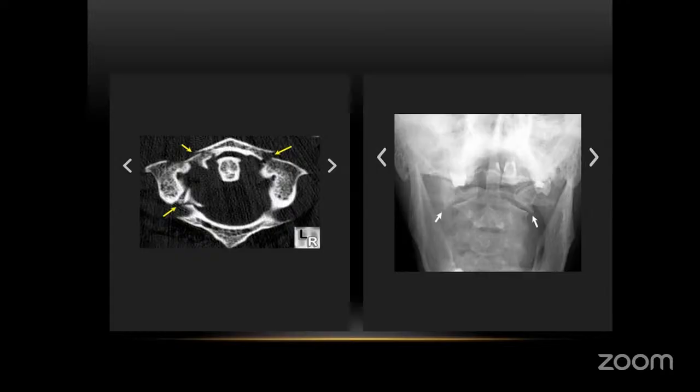When we talk about radiology, first, if the ADI is increased on X-ray, then there is a chance that the transverse ligament is disturbed. Second thing, who can interpret this X-ray? Which view is it and what are the findings in this X-ray?